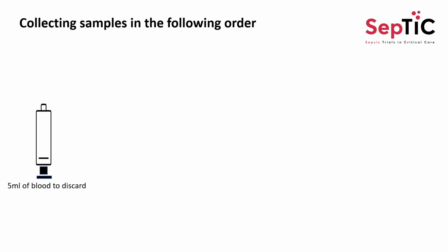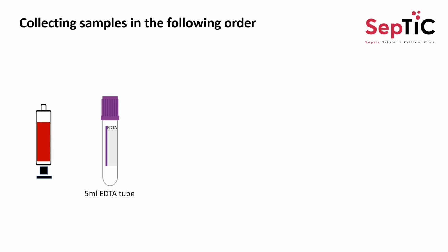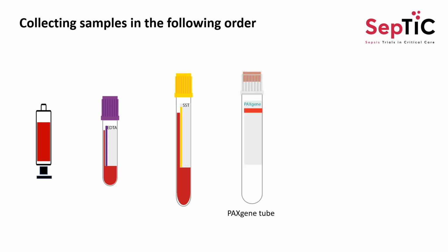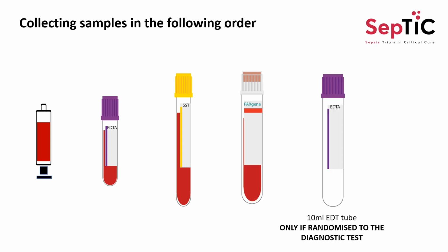If a sample has been drawn from an indwelling line, the first thing to do is to take 5 ml of blood for discard. Following this, fill the 5 ml purple top EDTA tube, then the gold top SST serum tube, followed by the PaxGene tube, and then only if the patient is to receive the PCR diagnostic test, you should fill the purple top 10 ml EDTA tube.